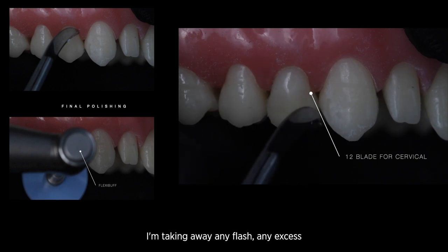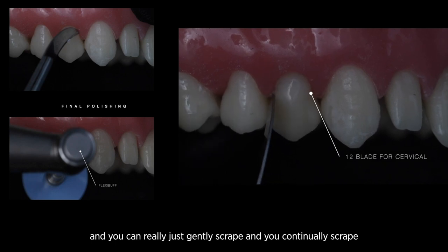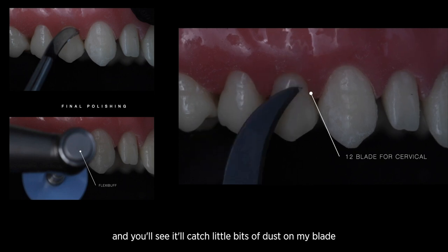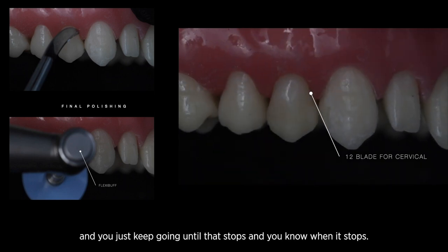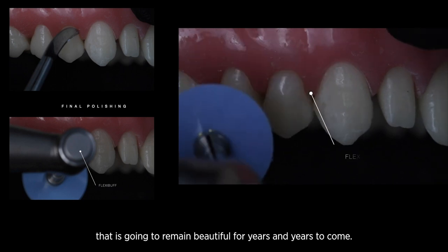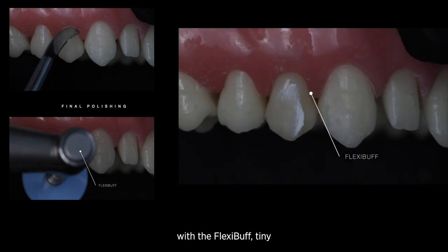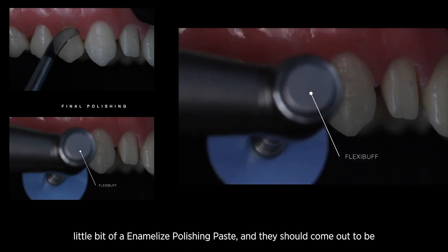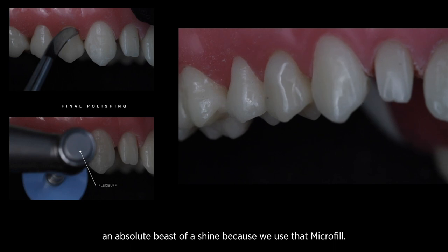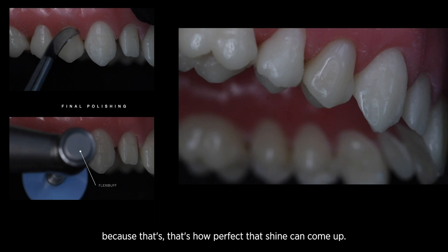A key point now is the 12-blade scalpel just under the gingival margin — I'm taking away any flash and excess. You just gently scrape with a slightly angled motion, and you'll see it catch little bits of dust on the blade. You keep going until that stops, and you know when it stops — that is going to be a restoration that remains beautiful for years to come. Then just a little hit with the flexi buff, a tiny bit of enamelized polishing paste, and this should come up to an absolute beast of a shine. Because we've used that microfill, you can't even tell which tooth we've treated — that's how perfect that shine can come up.